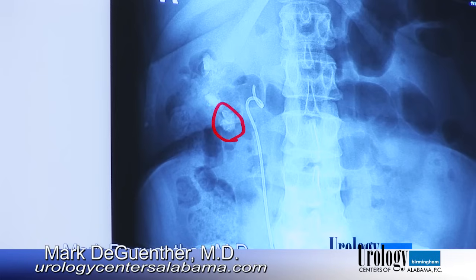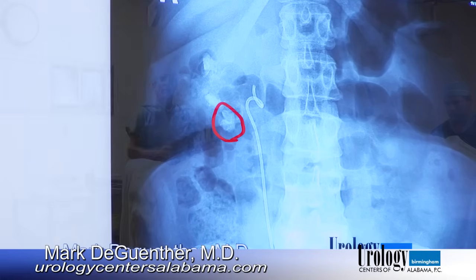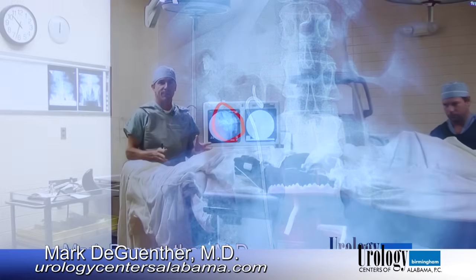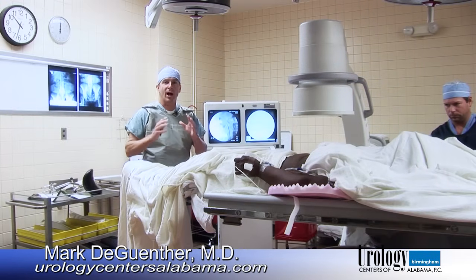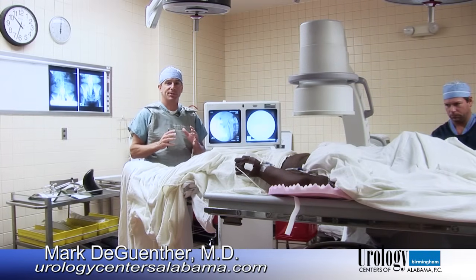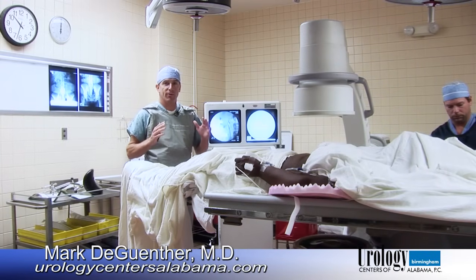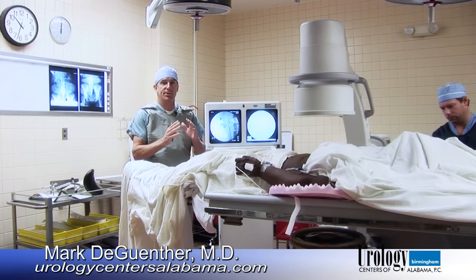We are going to start treating this stone in the lower part of the right kidney by using extracorporeal shockwave lithotripsy. Shockwave lithotripsy creates shockwaves outside of the body that are focused onto the stone.